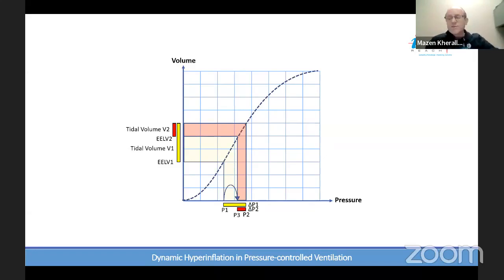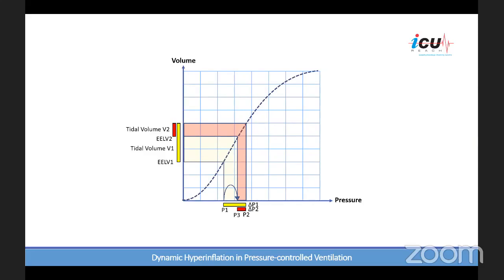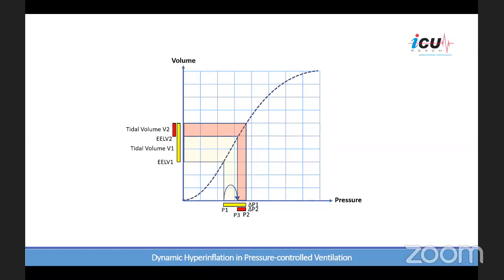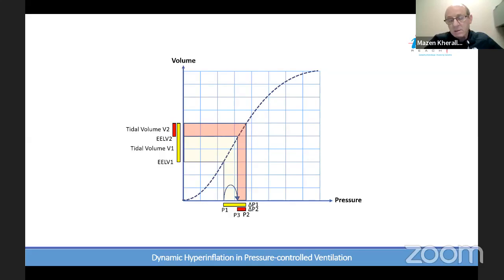Any other questions? There are a few questions in the chat. So one of the questions is, what about a brief disconnect to relieve the trapped air? Yes, and that's what we do in any severe dynamic hyperinflation that is associated with hemodynamic instability.